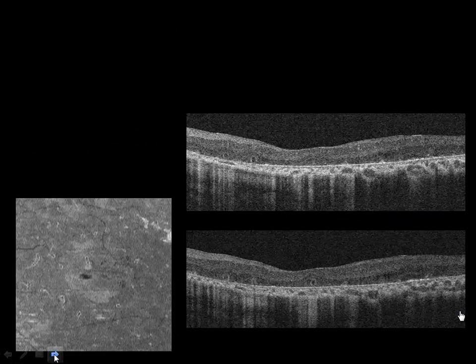And this is a patient who presents sort of like retinitis pigmentosa, where they have night vision problems, central acuity loss, and color vision loss, but they really have lots of trouble seeing at night, in a general sense. The cross-sectional images are on the right, but we can also take images as if you're doing fundus photography, but actually do it with OCT. And that's what we're doing here.